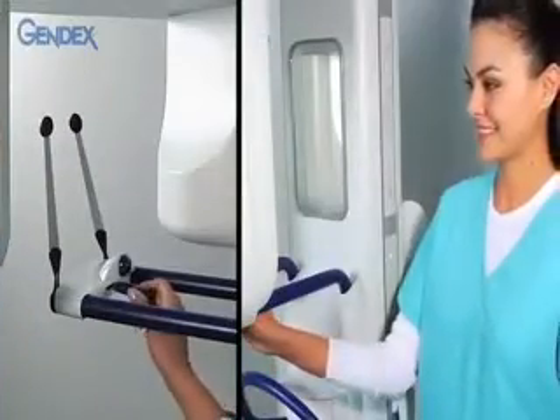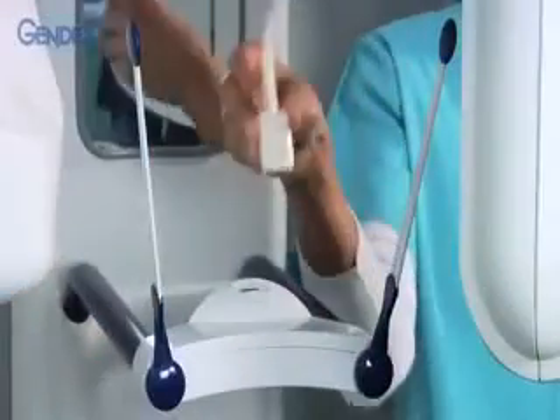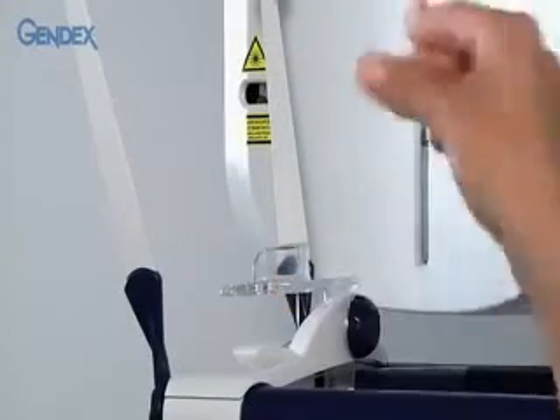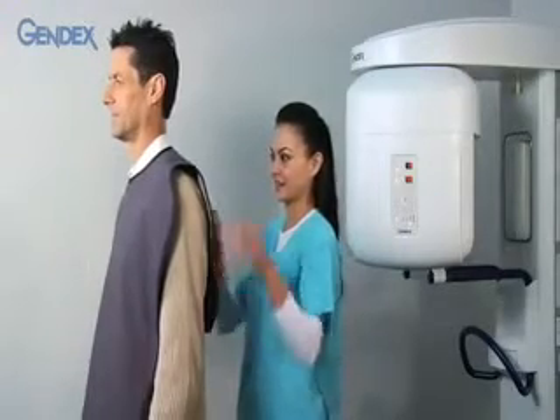Push the lever to open the head supports. Place a barrier on the bite guide and insert it into the bite guide slot. The chin rest should be used instead of the bite guide on edentulous patients or those who are missing anterior teeth. Place the appropriate lead apron on the patient.